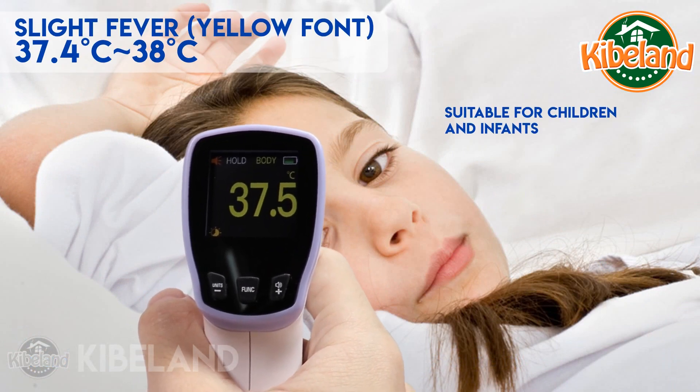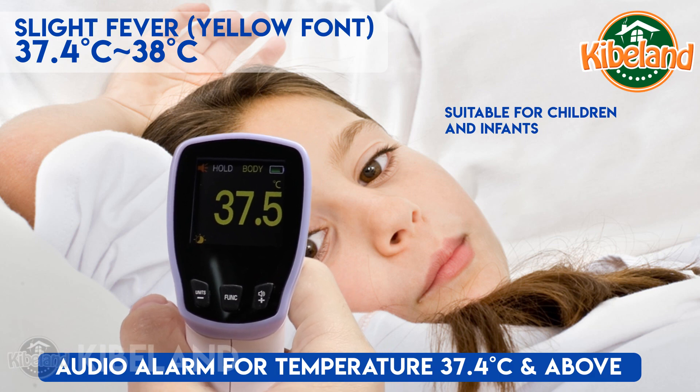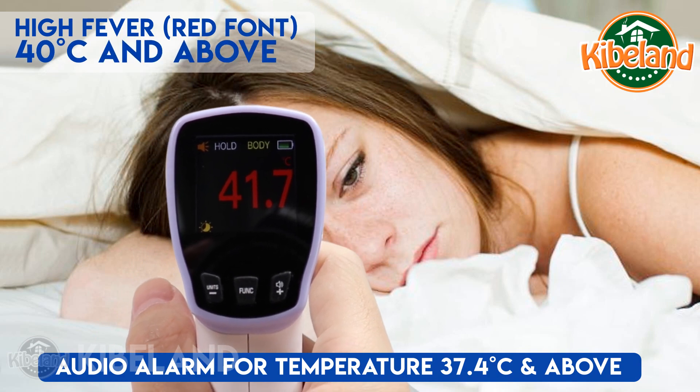This thermometer is suitable for children and infants. For a slight fever, the font becomes yellow and an alarm will be heard. Orange font will be seen if the temperature is between 38.1 and 39 degrees Celsius.